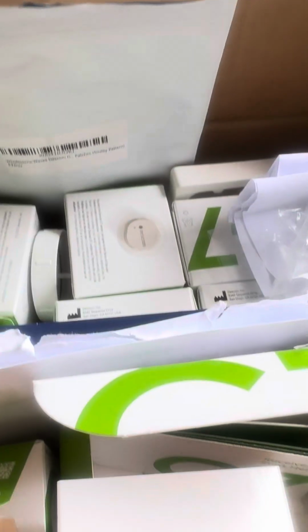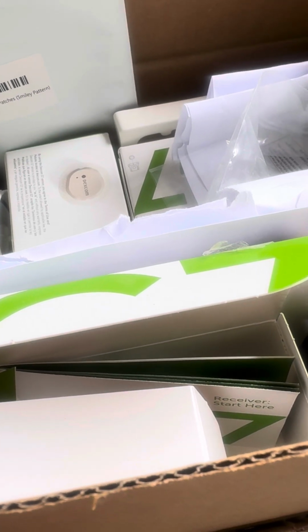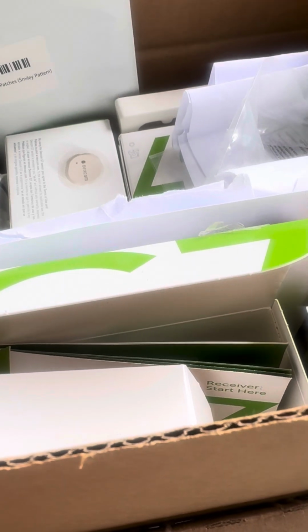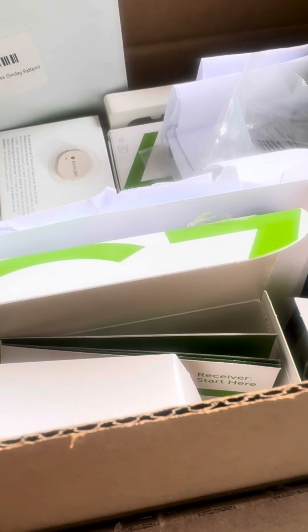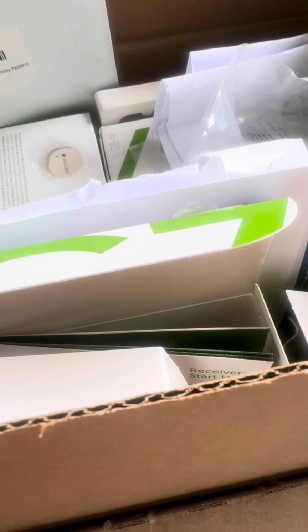The Dexcom 7 is awesome. A lot of people report problems. I haven't had any problems with it, other than the bandages. When I take a shower, I have to cut the bottom off a Ziploc bag, put it over top of it, and use vet wrap over top of that to keep it from getting wet, because I catch infections super, super easy.